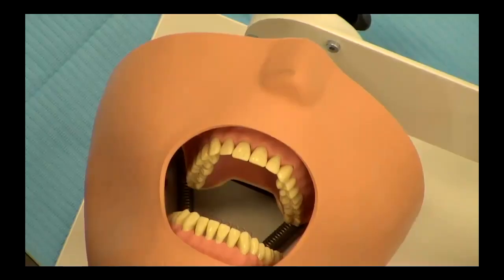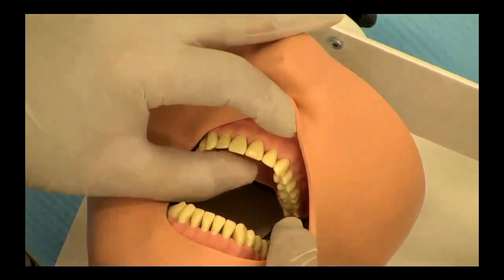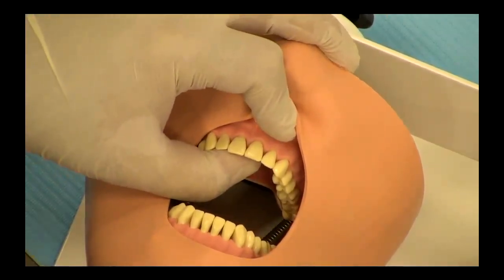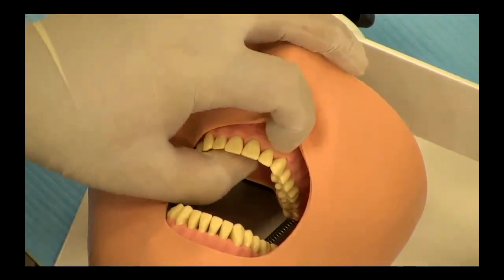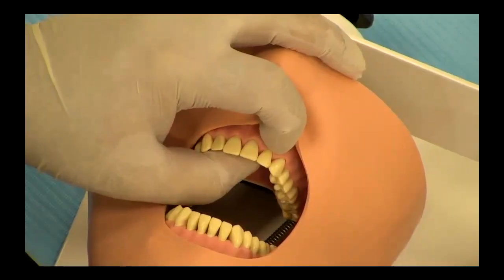Firstly, it helps you retract the soft tissues during tooth extraction, so you can apply your forceps, as you can see. Secondly, it helps you support the alveolus, so when you carry out tooth movements, the alveolus doesn't fracture. And thirdly, you will also get tactile feedback during tooth extractions.